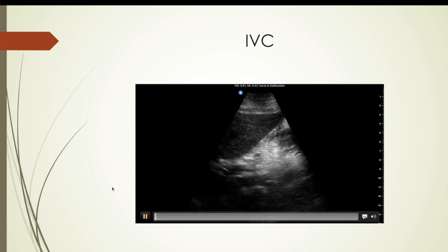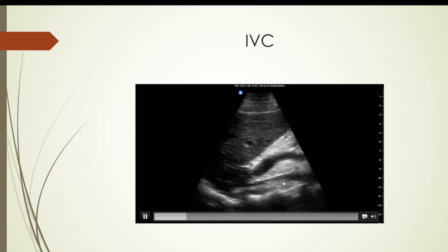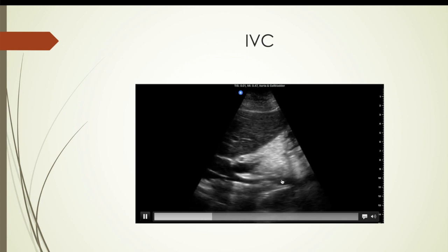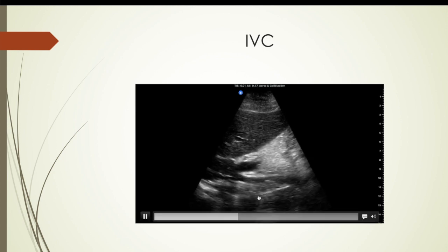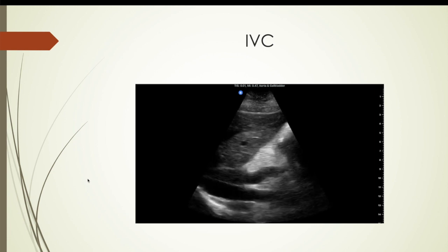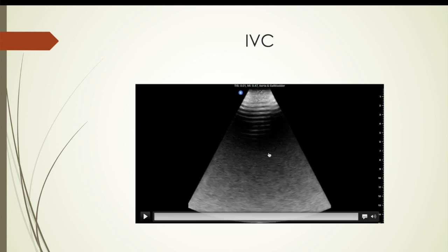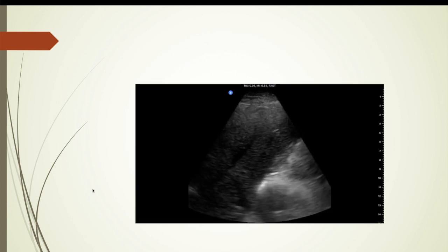Here is an IVC. You can see during inspiration it collapses somewhat and then fills back up. I had my wife raise her legs, and it's amazing how dilated the IVC gets with that — look at the size of it with her legs raised. Then she puts her legs down and it decreases, and with inspiration it gets even smaller. This was with the abdominal setting, and again, just a flick of the finger or thumb changes the settings.